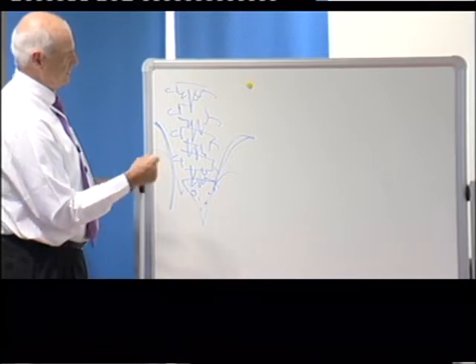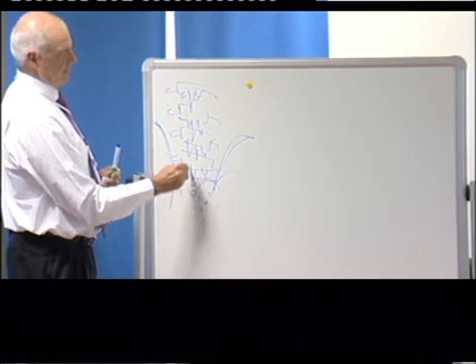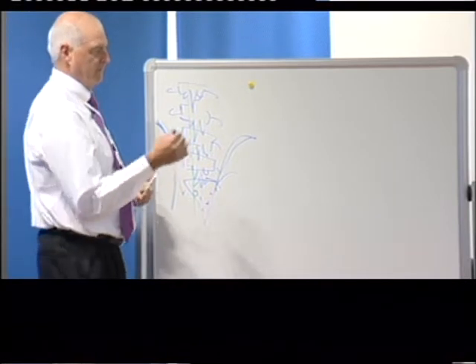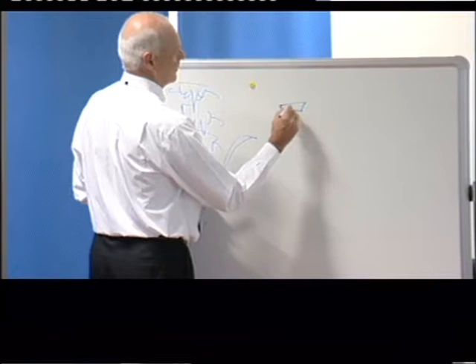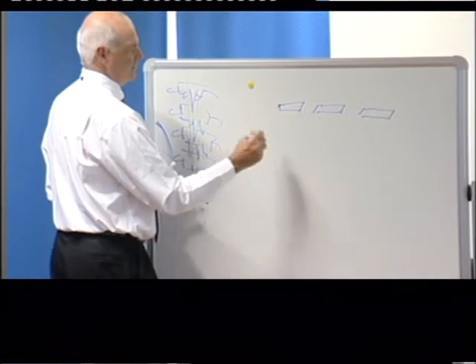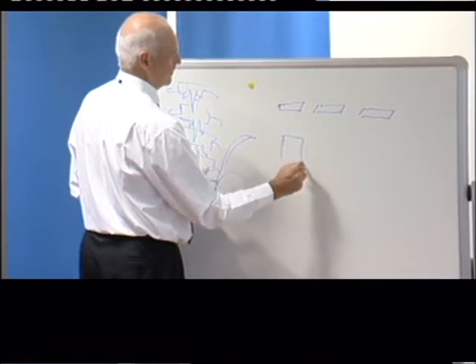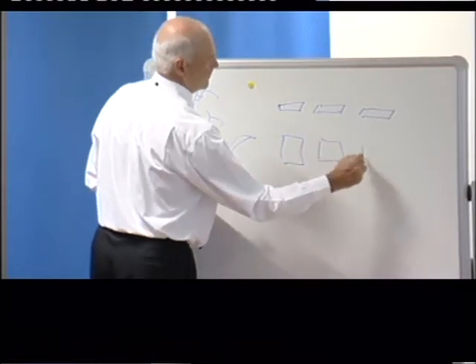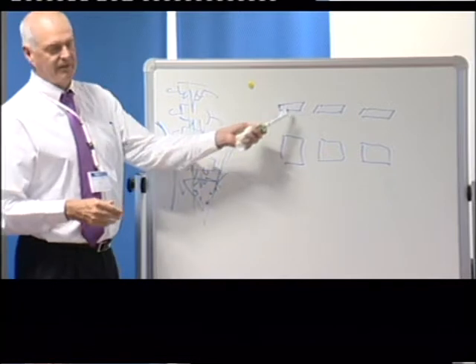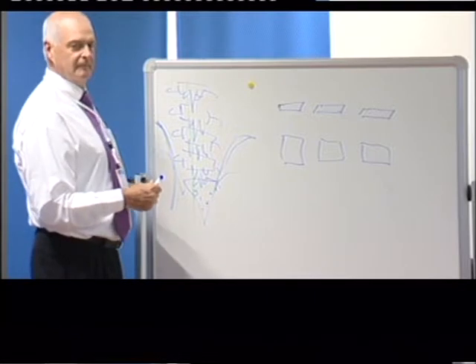So we're going to look first here at the lamina. Prima in asse lungo andiamo a guardare per prima cosa la lamina. There's going to be the lamina, and then, queste saranno la figura di come vedremo la lamina. And these are the vertebral bodies. And so you'll see what we call the horses' heads. Abbiamo il cavallo, le teste di cavallo.